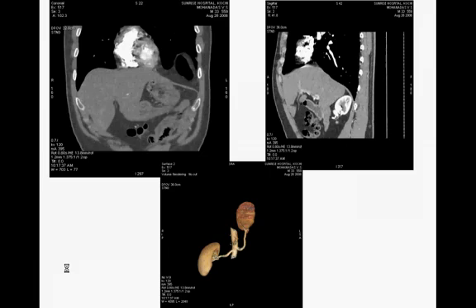From a radiologist's point of view, I can tell you that that is the future and that is what is being practiced now. If you take it in MRI or CT, especially the multi-slice CT, we evaluate all the structures in the coronal plane, sagittal plane and the axial planes, and also do a reconstruction of the structure. So that is nothing new for a radiologist to evaluate a structure in all the 3 planes and see the 3D reconstructions. Naturally, in ultrasound, the 4D scan is another logical extension of that approach, and we need to utilize that approach in ultrasound, especially in TIFFA scans.